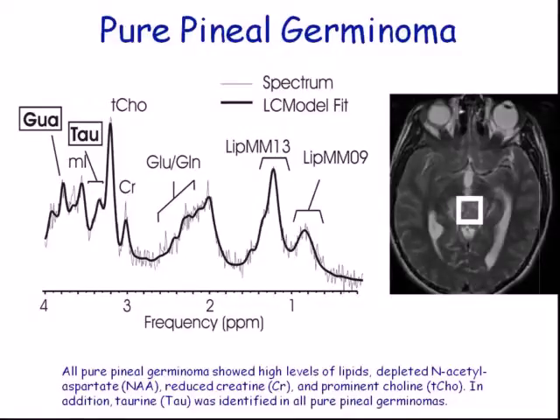What I have found when I was working at LA Children's, I worked with Jonathan Finley, who had a huge population of germinomas that were coming around the world to see him. So I had a lot of opportunity to see different types. I don't actually see this now in Pittsburgh, but I did do some spectroscopy on some of these different germ cell tumors. And the one thing that I found, if you do short echo, they do have taurine. It's very similar to medulloblastomas, which makes sense because they're sort of that PNET, round blue cell type lesion.